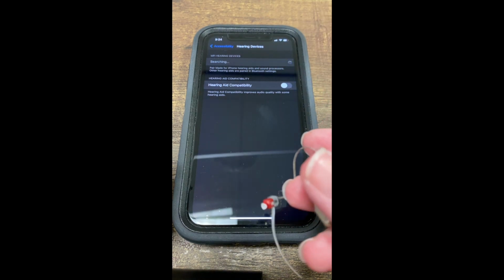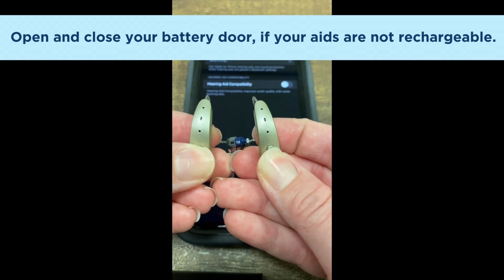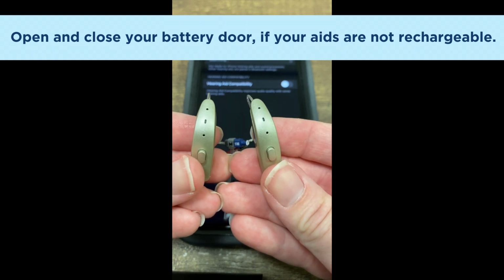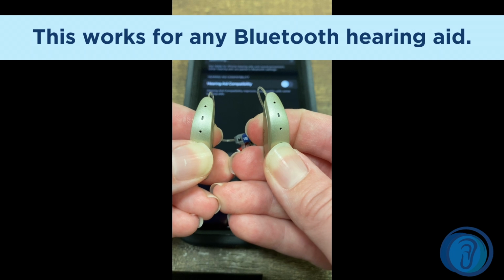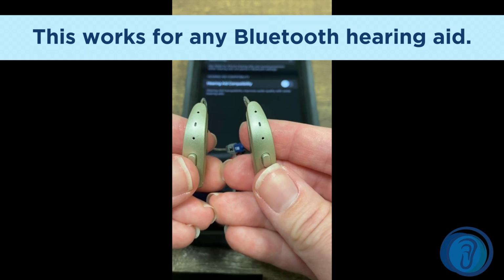Now it's searching, so what you'll want to do is go ahead and turn your hearing aids off and back on by pressing that button until you see about 3 green flashes. Then you can let go. So now the hearing aids are off. Then you'll go ahead, press that same button until you see a single flash. There you go. Now they're turning back on.